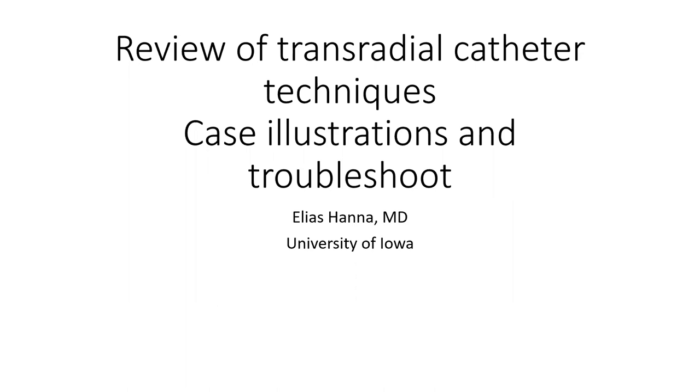I will be reviewing today some radial techniques for left and right coronary engagement and LIMA. I have been observing what mistakes fellows make at this stage and what basic tips they keep forgetting. I have put together videos of catheter manipulations and troubleshooting. I will ask you to think about the next step throughout those videos and how to correct the handling of the catheters.